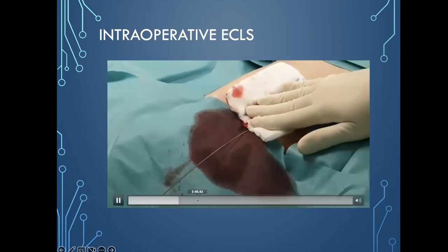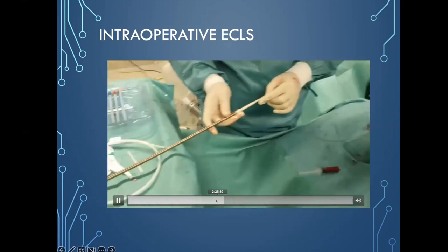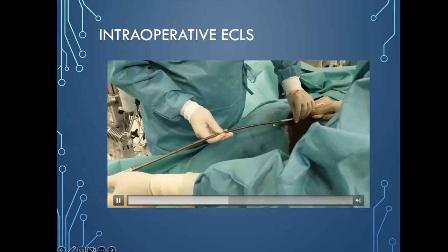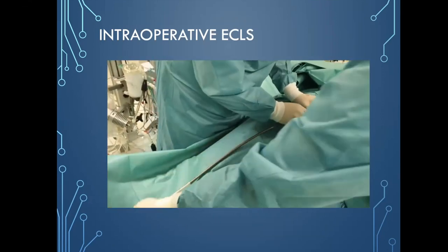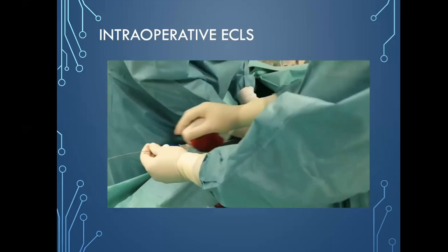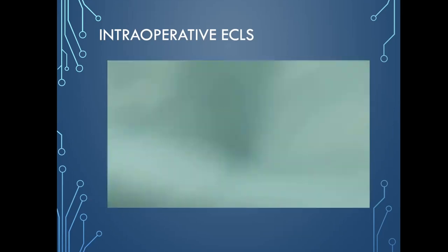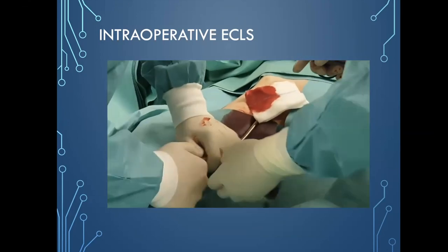And after inserting all 4 dilators, you get your cannula, as you can see, and there is this spot about 5 centimeters where the cannula meets this wire, and you always have the feeling that you get this resistance. This is okay. Just push it. This is the only thing I tell my trainees. Don't worry. You did everything right. So if you get this resistance, just go for it. It's all normal. If you've done everything before really smoothly, this is not a problem, because it is usual to have this resistance. It's just this one spot.